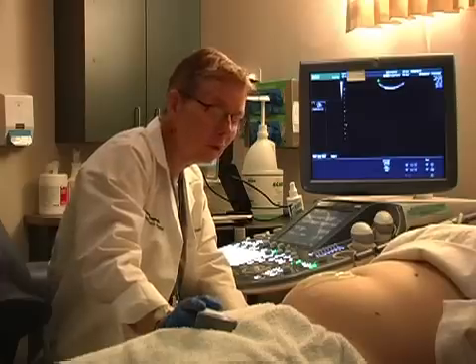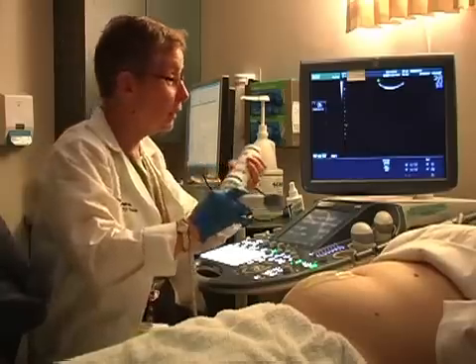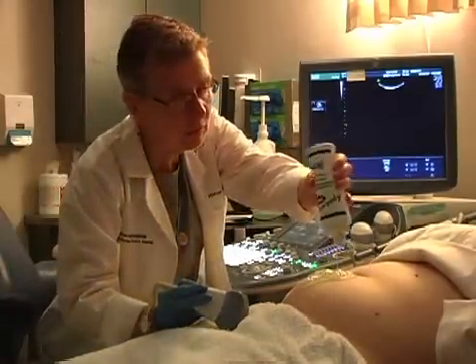An ultrasound. All right. So I'm just going to put some gel on your abdomen. We tend to put on a lot of gel, and that's a little bit helpful.